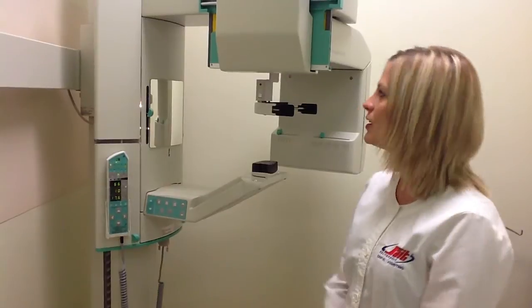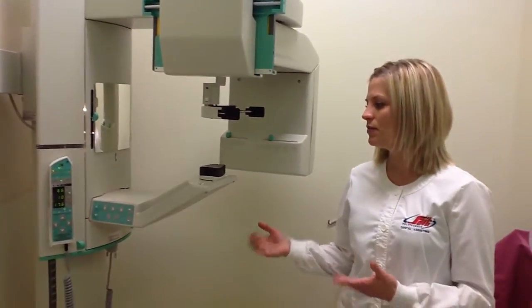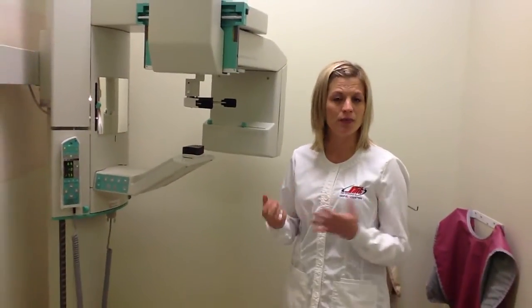Okay, so we have our machine all set up, ready to go. Now it's time to invite our patient into the area.